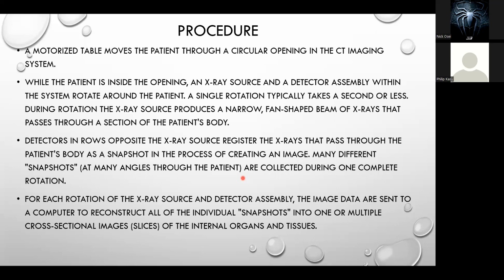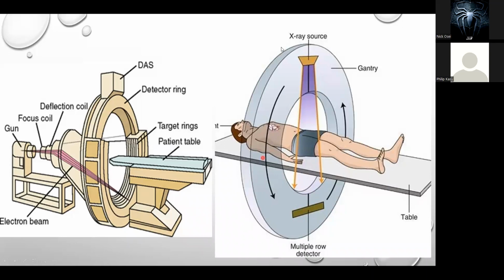So when you have many organs and tissues. So there's all that I've just said again. The thing just rotates around. The source and the detector will move around like that and take shots.